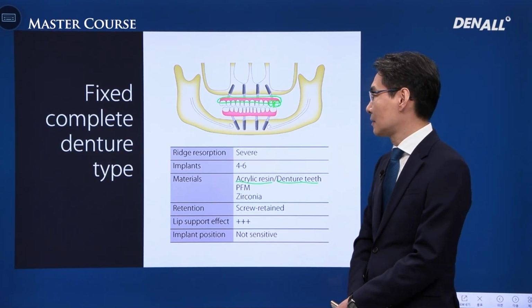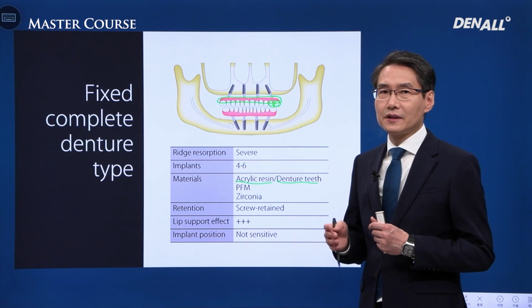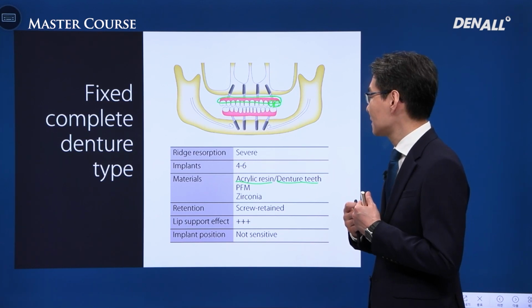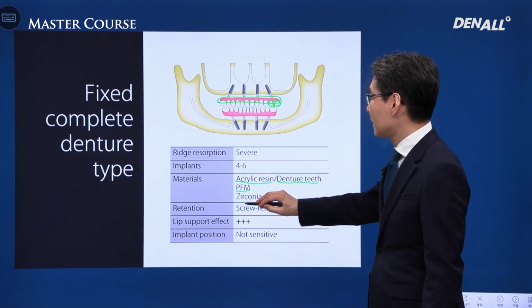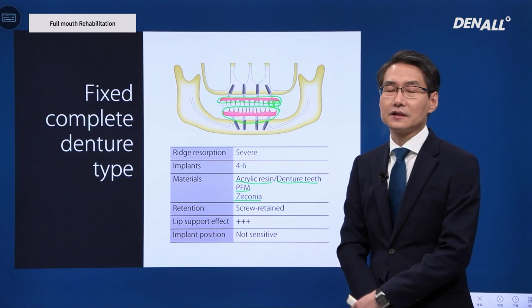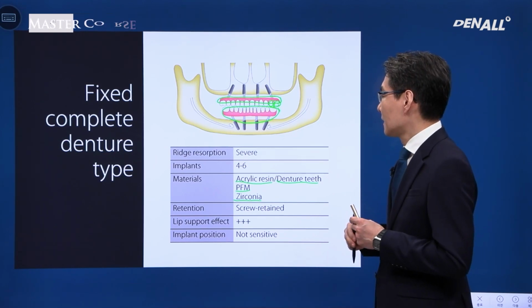In the same way as fabricating full denture, if you use resin, it can affect durability significantly. Resin or artificial teeth can fracture, frame can fracture. There can be many different mechanical problems, so currently it's not really in use. So these days we either use PFM or we make the entire prosthesis in full zirconia, and it is milled and pink coloring is added.